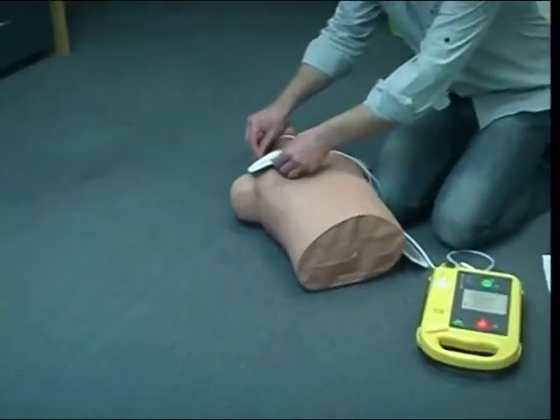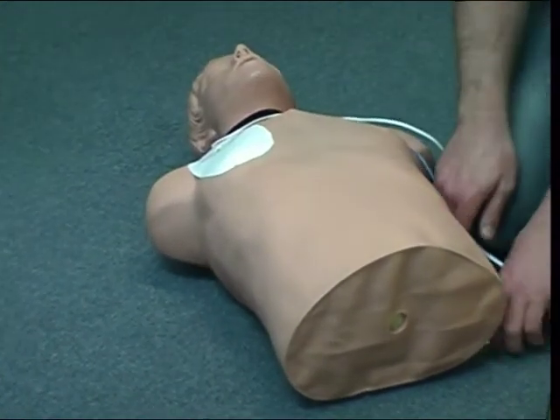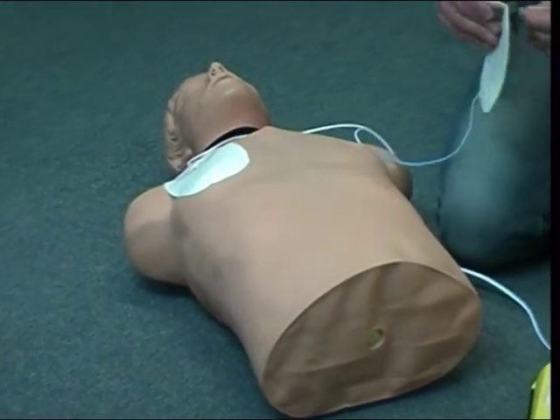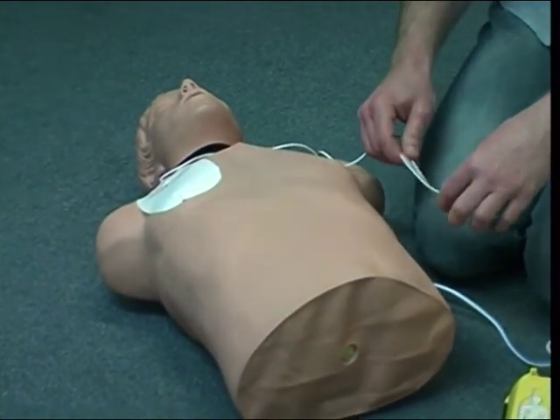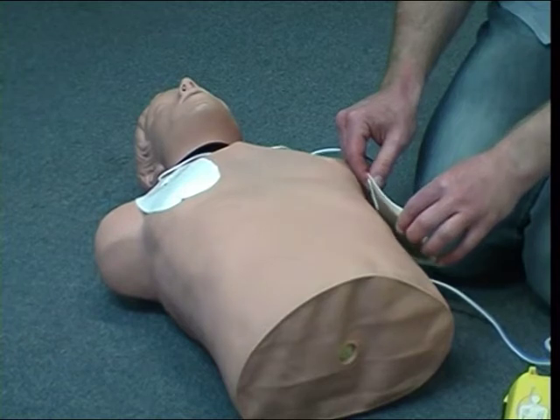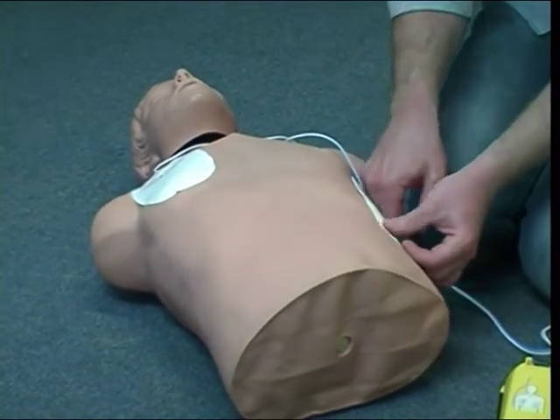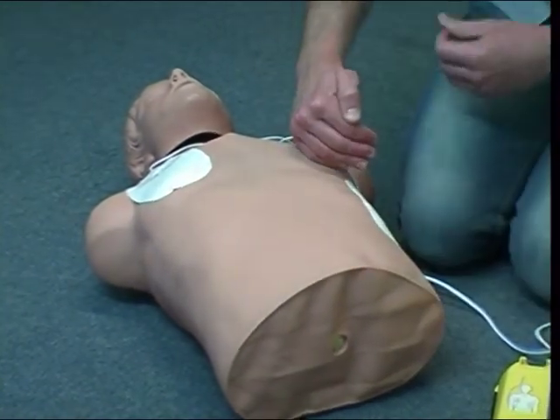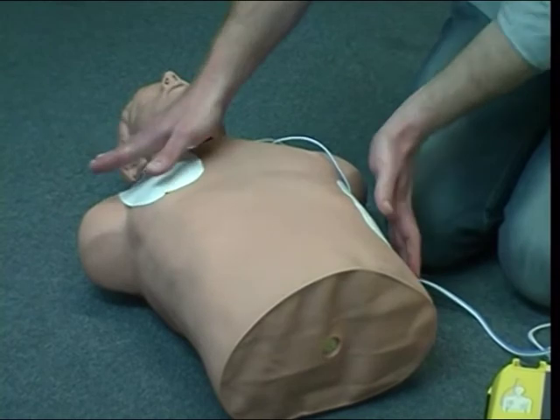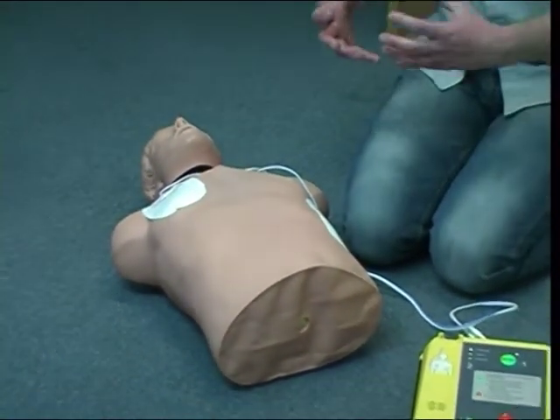So one goes on the right side of the person's chest, just below the clavicle, or the collarbone. The other one goes on the left side of their chest. And the key with this one is that it goes on the chest wall. So particularly if there's a bra in the way, you will need to get it up out of the way to get the pad on. If this person has a bra on and it doesn't interfere with you getting the pads on, feel free to leave the bra on because it just keeps everything contained.